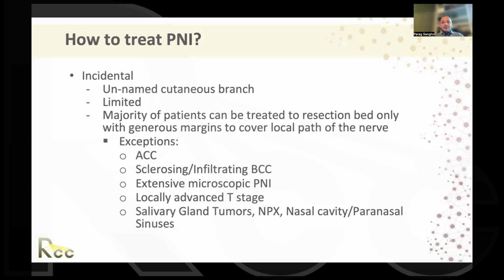So I think for us, really, especially if the decision is just to add postoperative radiation to the resection bed with electrons, this should be an easy decision for us. Really, don't perseverate about nerve caliber. Don't perseverate about named nerve. Just add radiation, particularly for squamous cell carcinomas and basal cell carcinomas. I think that you should do that.